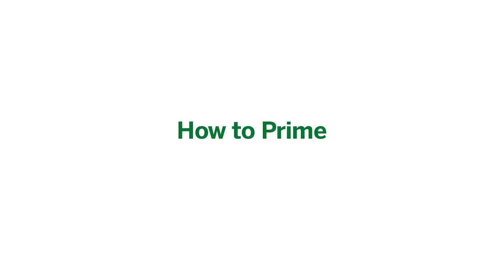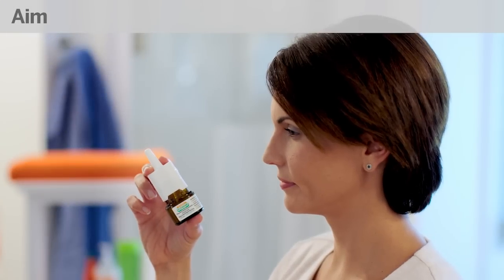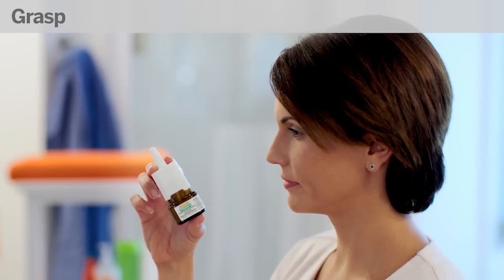Any time you clean the nozzle, you'll need to prepare it for use by priming it, just the way you did the first time you used the bottle. To prime the nozzle, first aim the bottle away from your face. Grasp the spray bottle like this, then pump until fine mist appears.